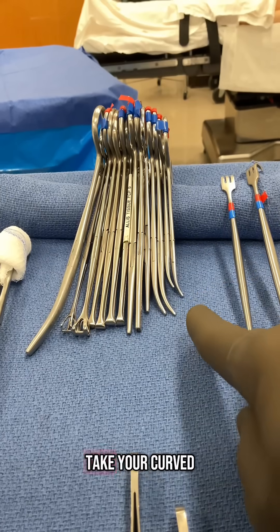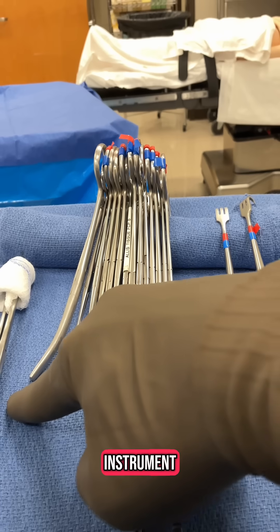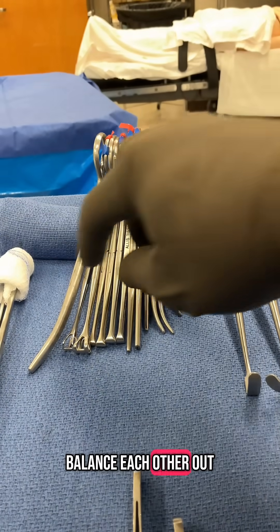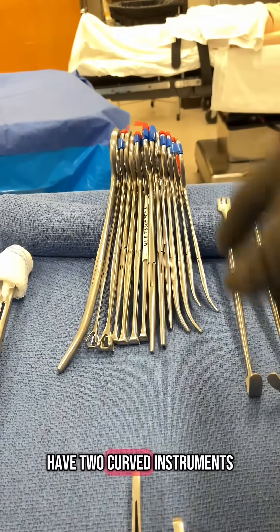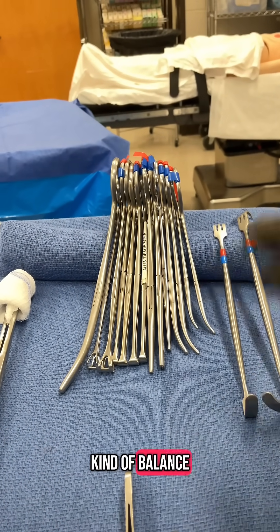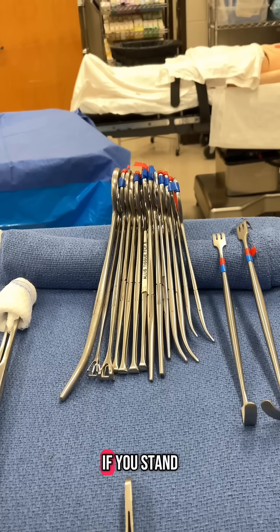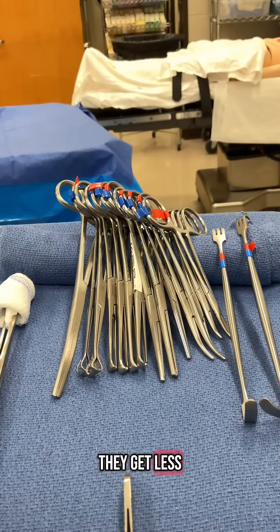If you take your curved instruments and put them on edges — curve one this way, other curved instrument put it the other way — they will balance each other out and keep them from tipping. If you have two curved instruments, you can face them in opposite directions and they will balance each other and stand straight up. If they stand straight up, they're easier to grab and easier to see, and they get less jumbled up.